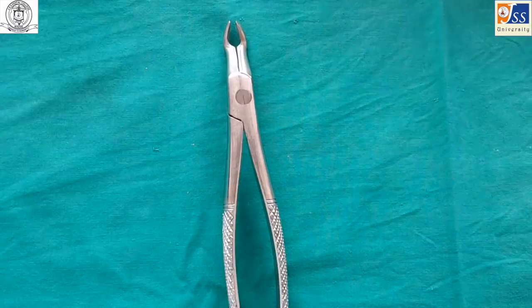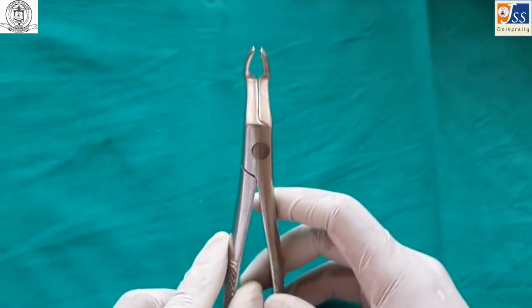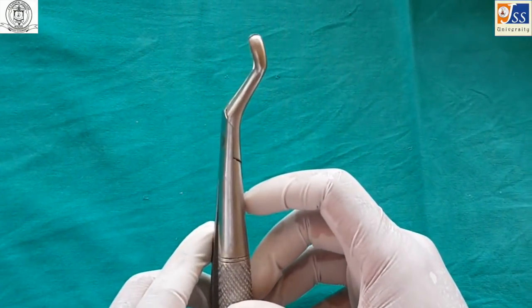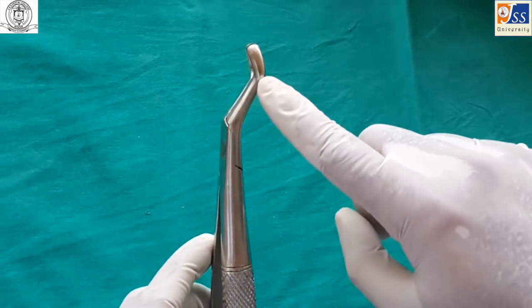The maxillary third molar forceps is designed for maxillary third molars, which often have fused and bulbous roots. The beaks are rounded, and the handle is sharply bent to facilitate better reach.